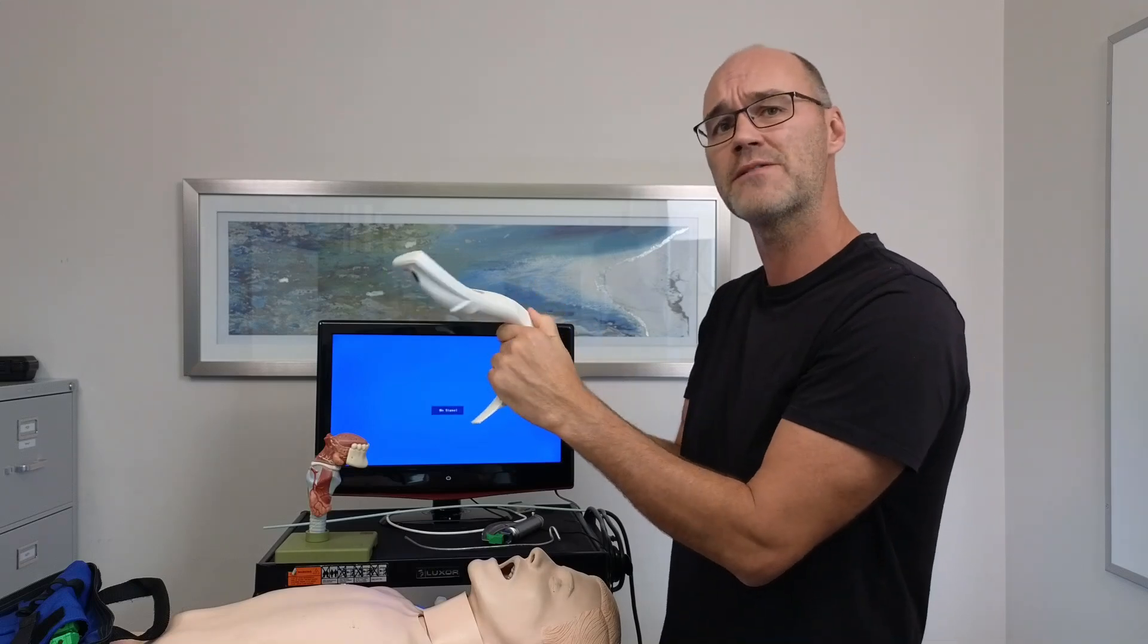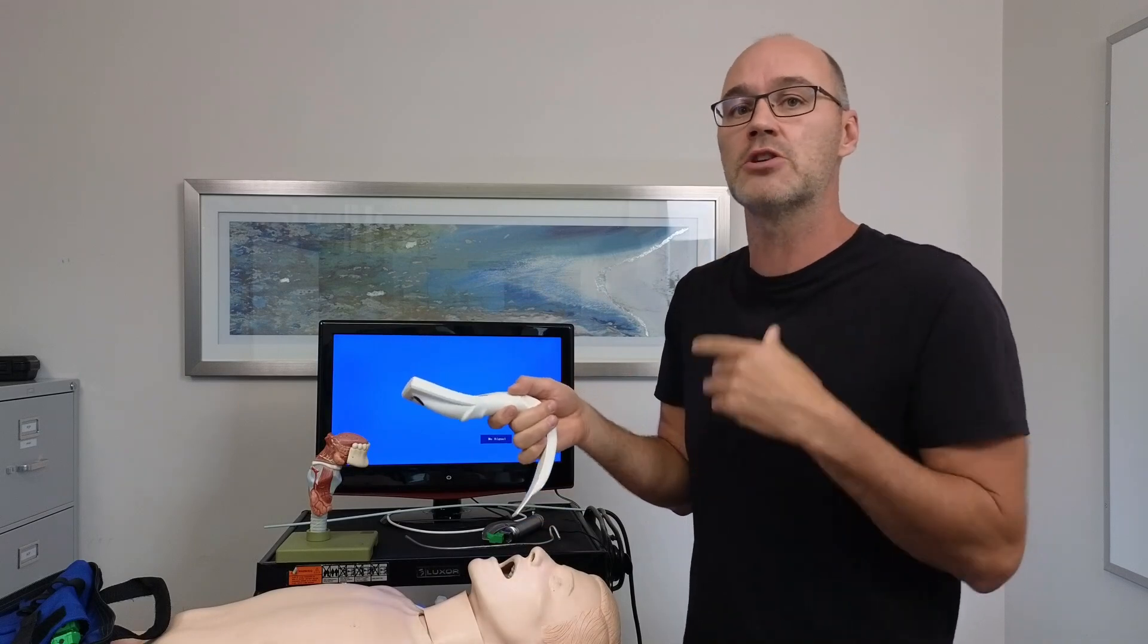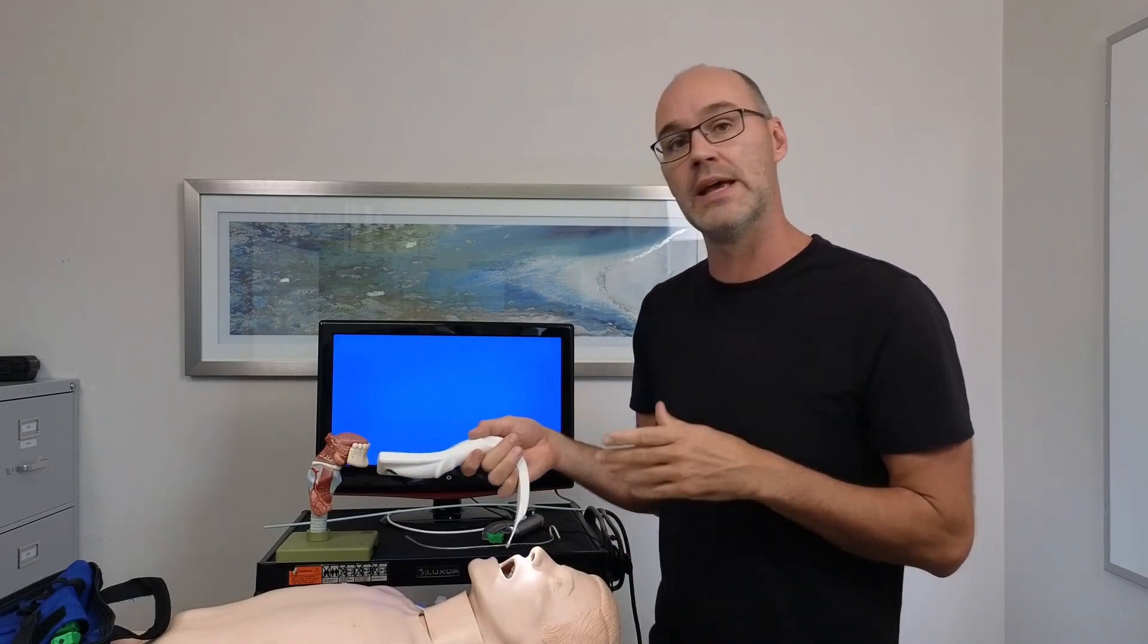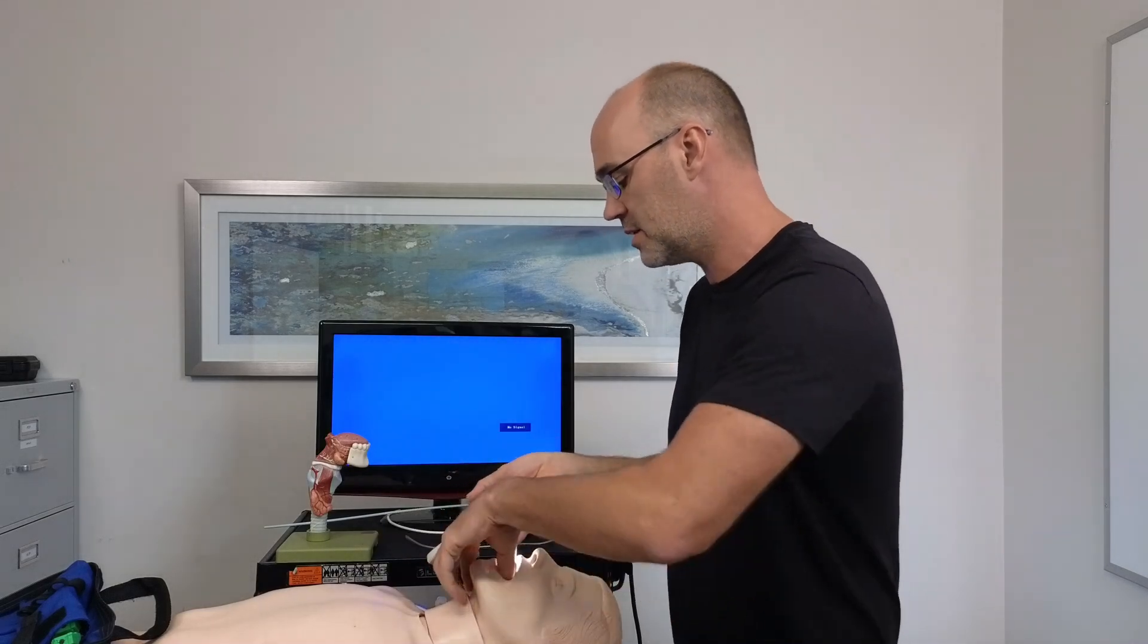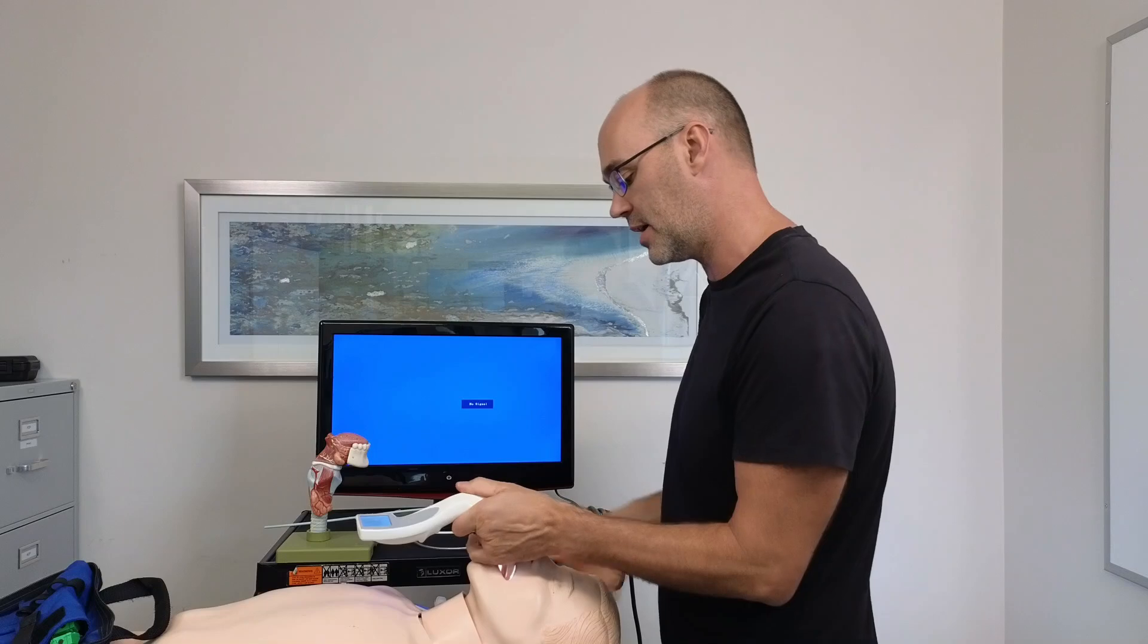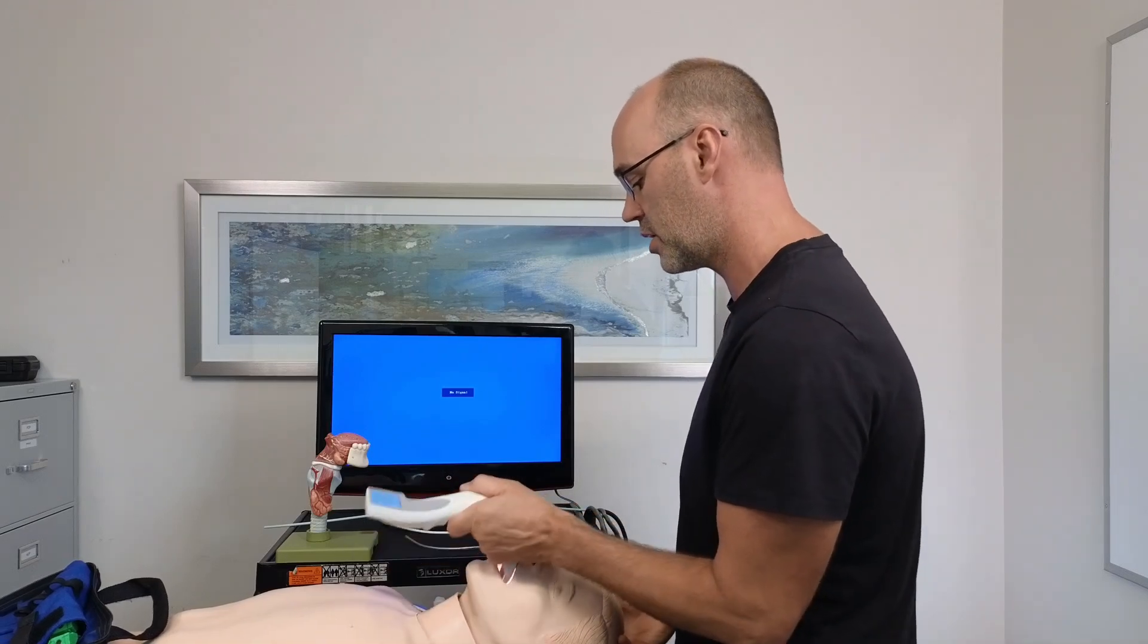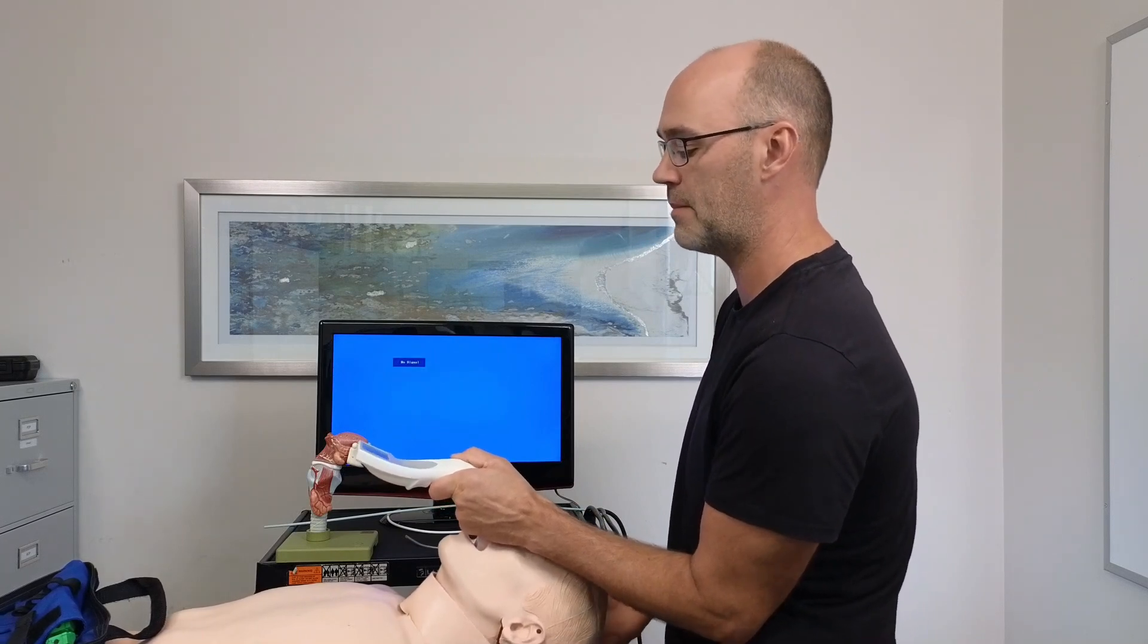I know we often all hear in paramedic circles, people talking about the teeth. Yes, but you will traumatize the soft tissues well before you could damage teeth. Both would be poor to do. So as we insert into the mouth, we're going to look into the mouth, walk our way down the tongue. This is with a Macintosh. We're going to try to get into the vallecula and then lift up.